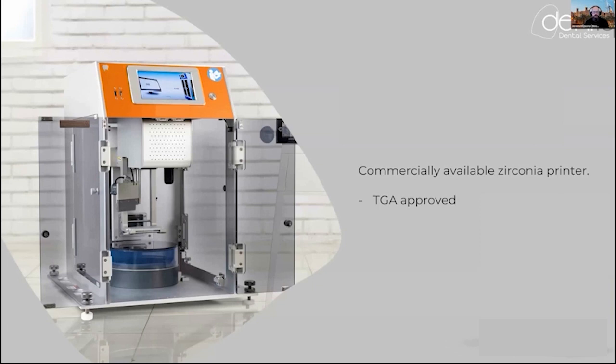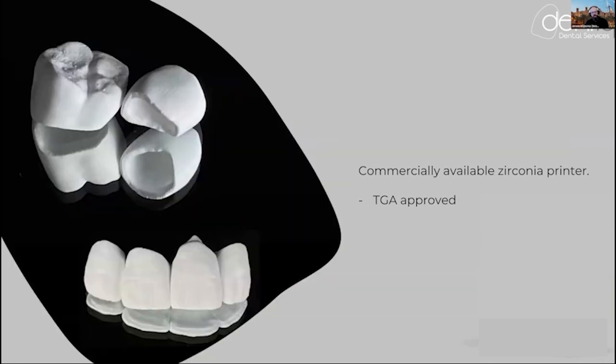It is really cool because this way we can 3D print, like I said previously, our substructures or monolithic full contour crowns. It is really accurate. The fitting is just, I have been absolutely blown off my feet with how accurate these prints can be. And the aesthetic results, we're getting there. These materials, these Zirconias, are still the Yttrium 3, and the Yttrium 4 is basically in development and testing. And we're also already looking at the Yttrium 5, so the more translucent Zirconias. And if we can do that, we can have full arch Zirconia.